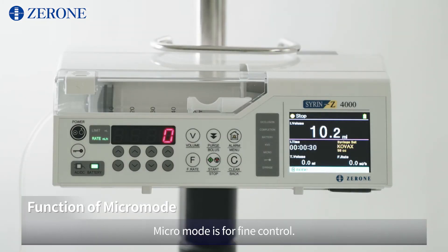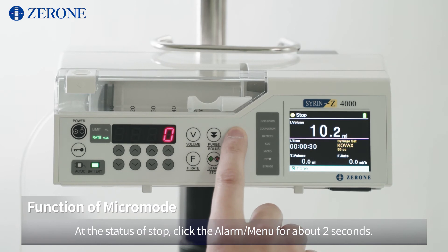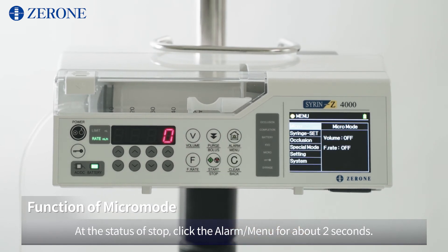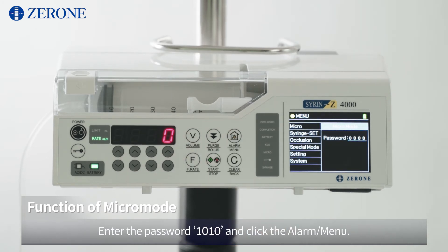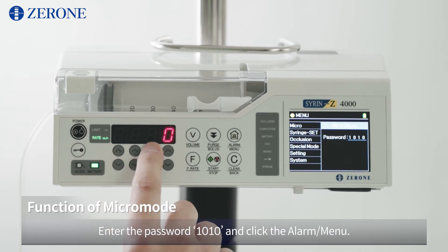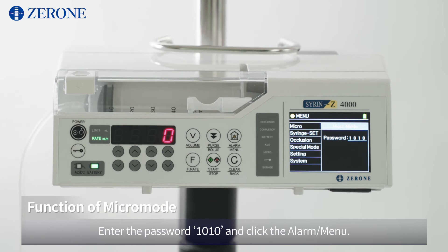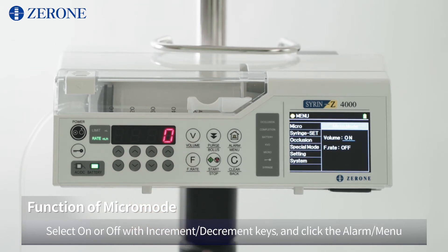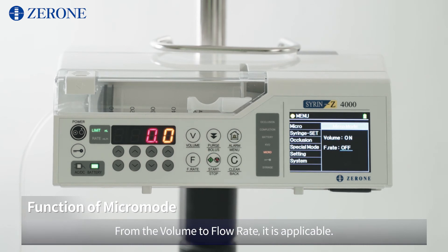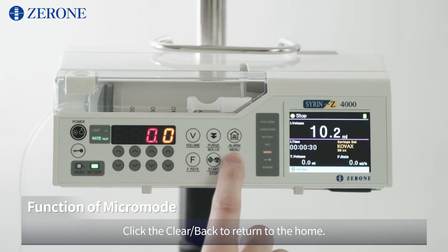Micro mode is for fine control. At the status of stop, click the alarm menu for about 2 seconds. The LCD will change to the menu. Check the micro mode at the first line and click the alarm menu again. Enter the password 1010 and click the alarm menu. Select on or off with the increment and decrement keys and click the alarm menu. From volume to flow rate, it is applicable. Click Clear Back to return to home.